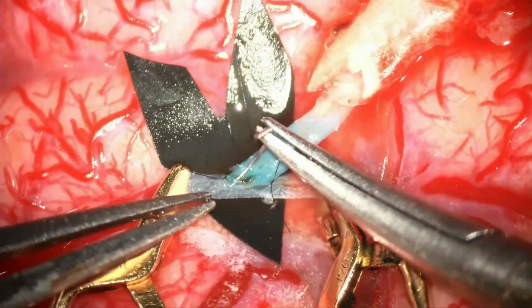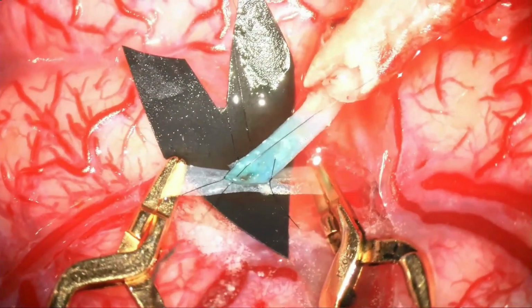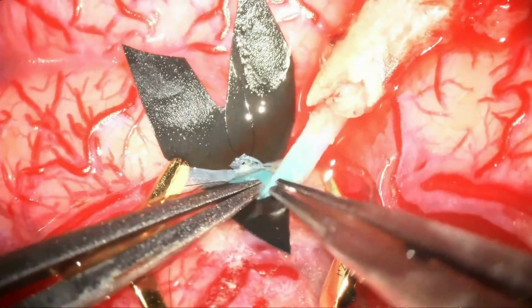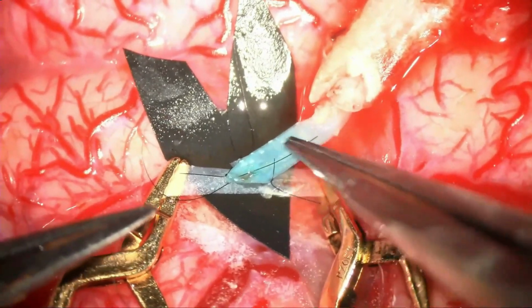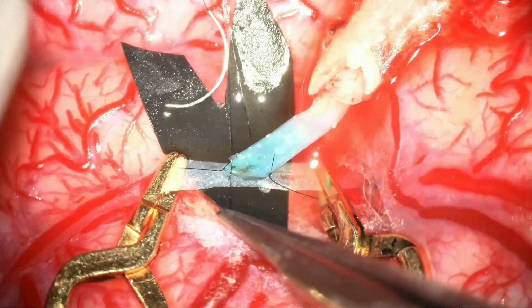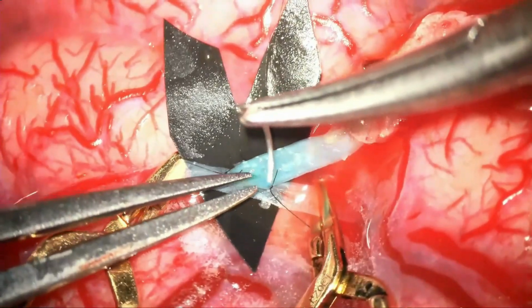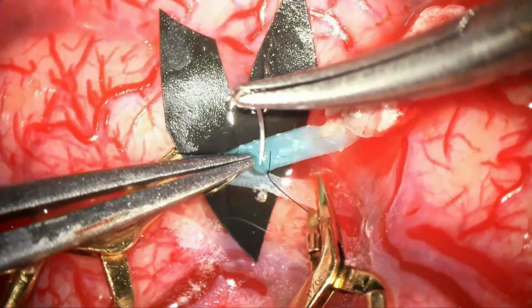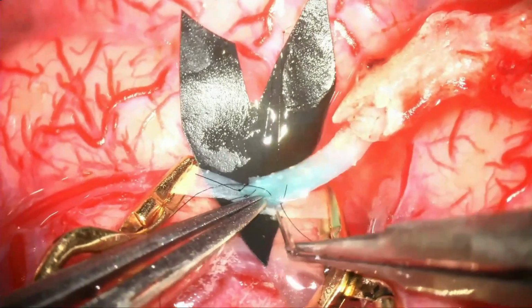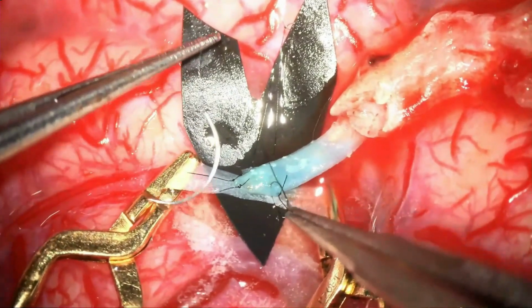Intermittent suturing is started on the side opposite to the arteriotomy flap, and opposite wall involvement by the suture is confirmed by turning the STA as shown. Other sutures on this side are completed in similar fashion. Only two reef knots are taken each time.